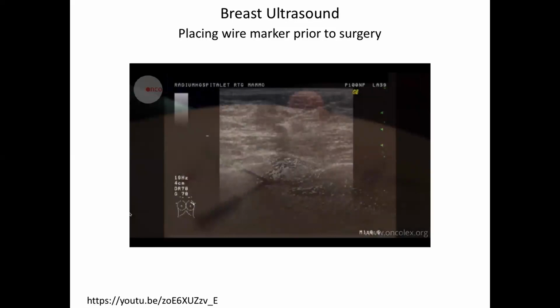And you've got the transducer that you've got to keep on plane, right? And hit the target, right? So it's a particularly human thing. I think teaching a machine to do it would be quite difficult, right? Because of the underlying motion and everything that's going on.